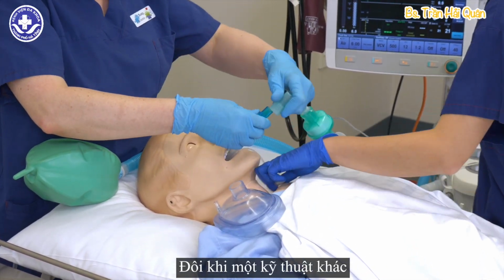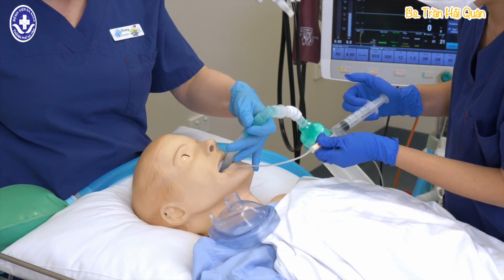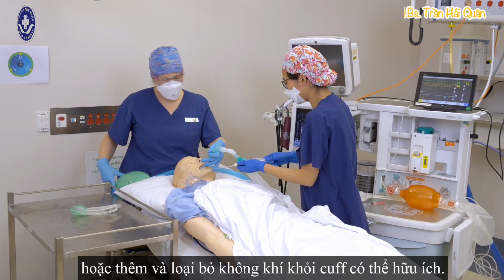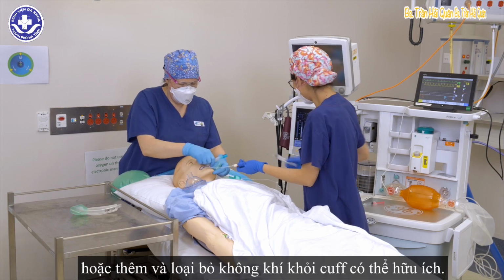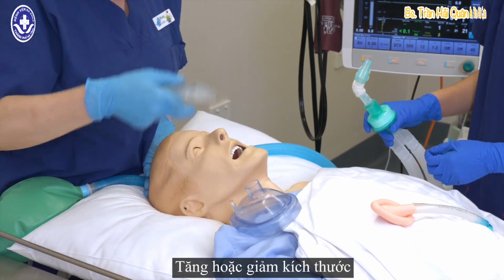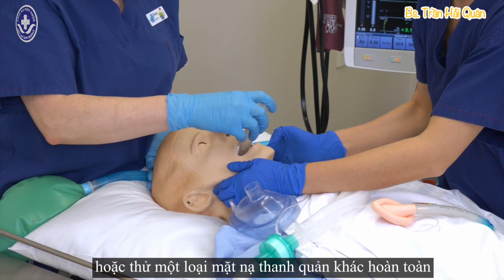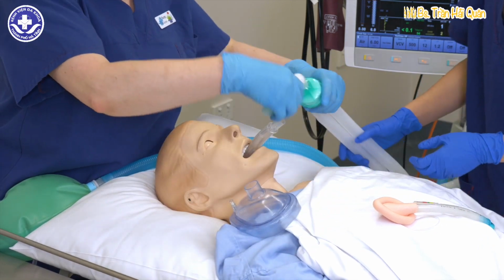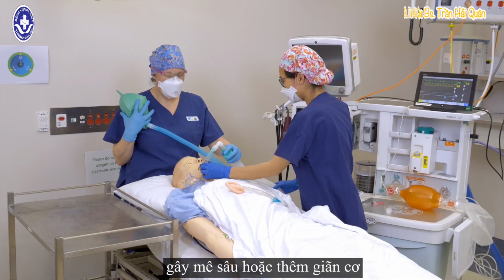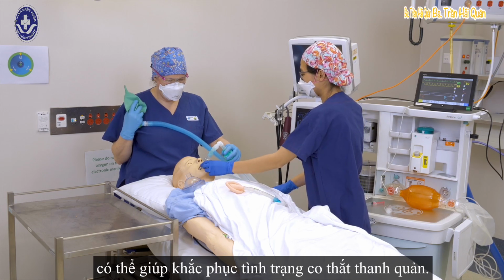Sometimes a different technique, such as twisting to get around the tongue, using a laryngoscope, or adding and removing air from the cuff can help. Sizing up or down, or trying a different type of laryngeal mask altogether can be useful. As with mask ventilation, deepening anaesthesia or adding muscle relaxation may help to overcome laryngospasm.